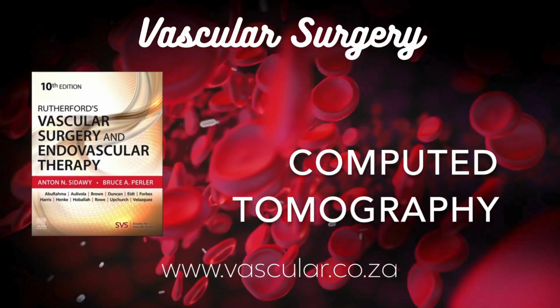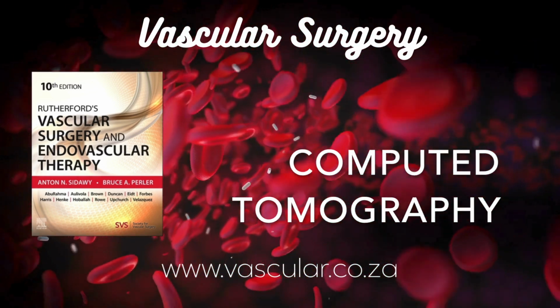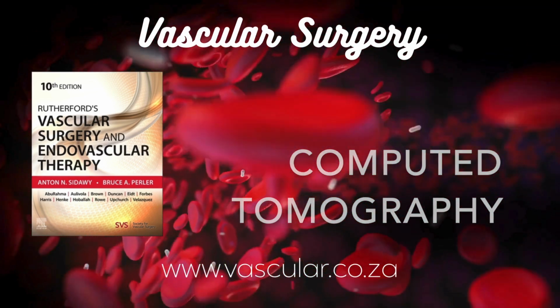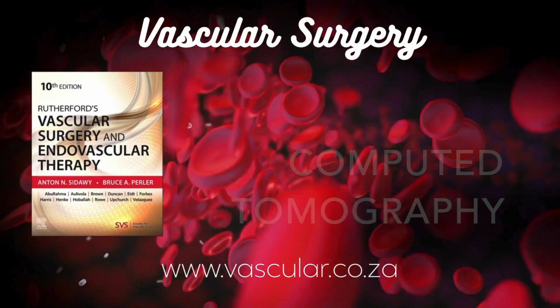Got it. What about collimation? Collimation is about shaping the X-ray beam, specifically its thickness as it comes out of the tube. This fundamentally determines the thinnest possible slice you can reconstruct later on and impacts the resolution along the length of the patient, the Z-axis resolution.